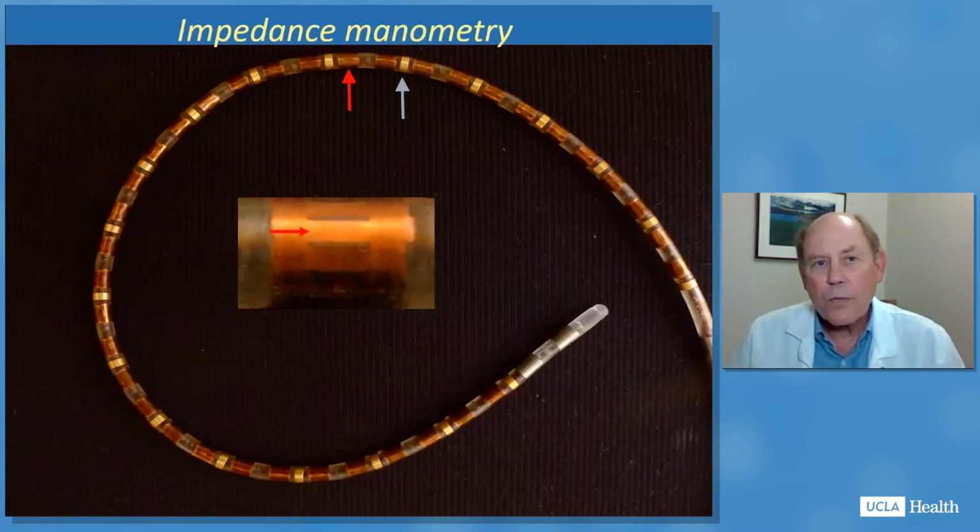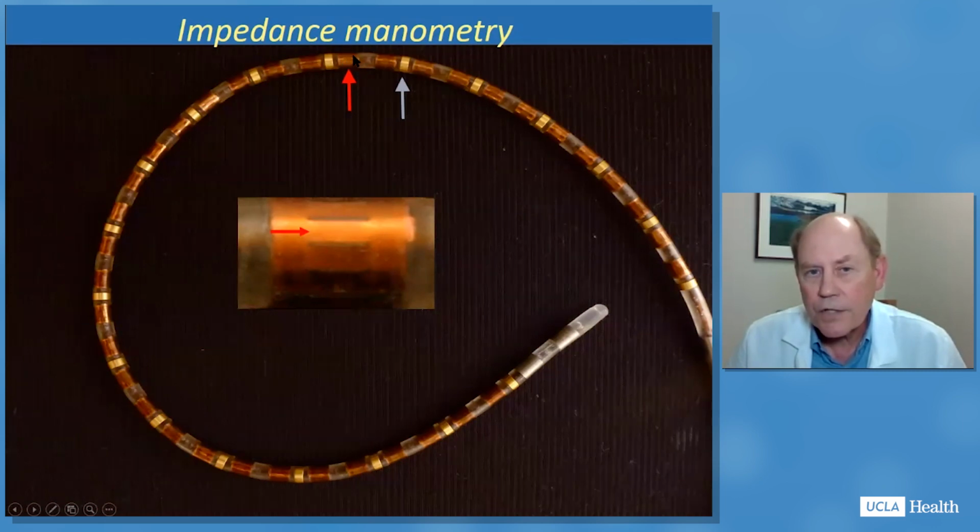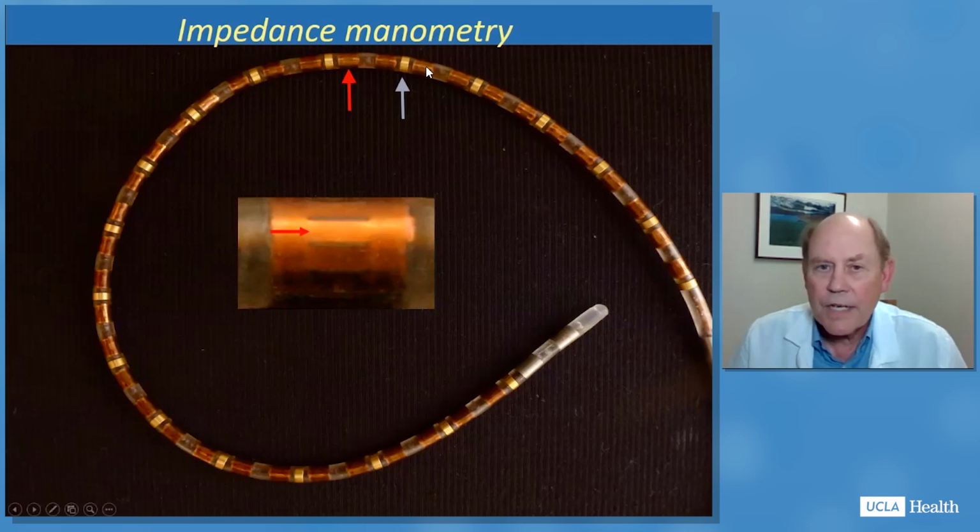pH testing. We also have impedance manometry that we use. This is an impedance manometry catheter. These copper colors are pressure sensors, and actually each of these has 12 circumferentially arranged pressure sensors. There are 36 of these pressure sensors. They are located 1 centimeter apart on center, and that makes the operating length of this catheter 35 centimeters.